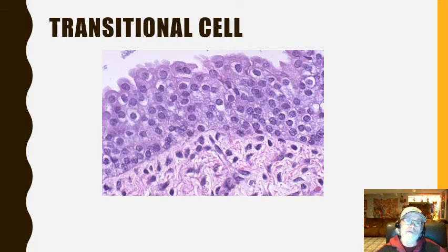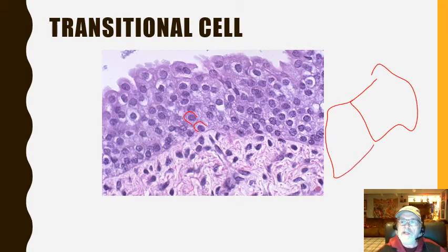This is a typical photomicrograph. And you just look at the cells, there's really not that much order to them. You see here's a cell here, and that looks a little bit different from there. They're not quite as flat and oblique looking as we saw with the squamous cells. They're sort of cuboidal, with a little bit of a cuboidal appearance, maybe a little squamous appearance. Some of them are a little bit taller, might look a little bit like a columnar cell, but they're none of any of those.